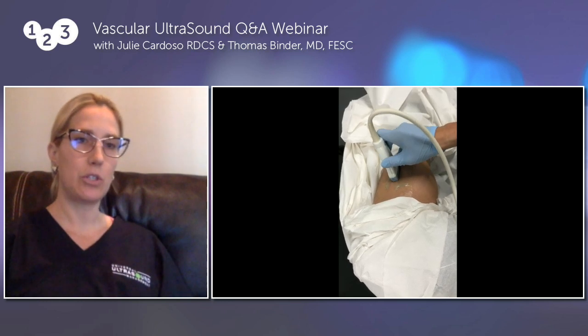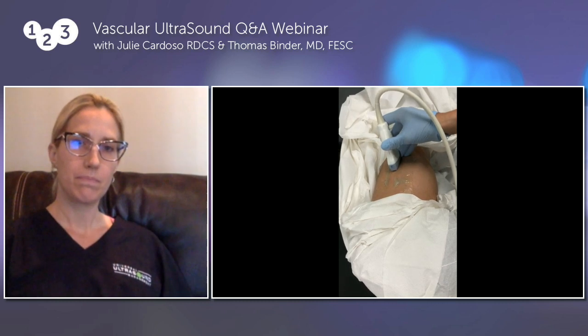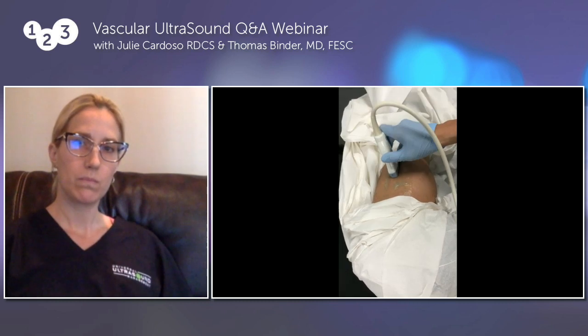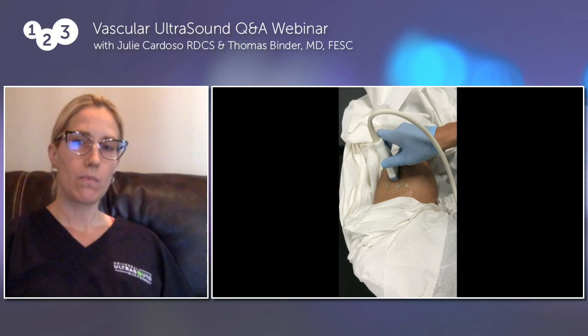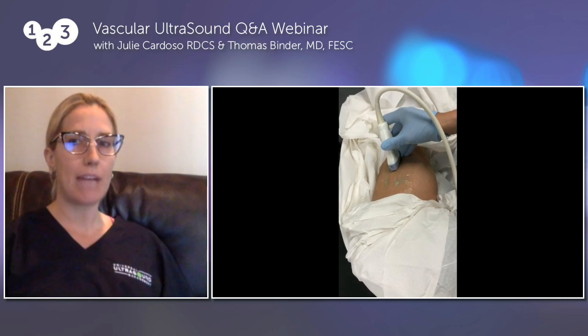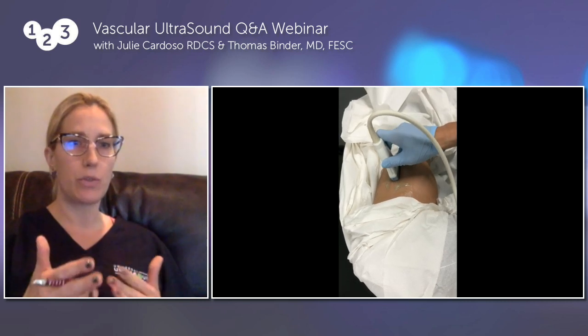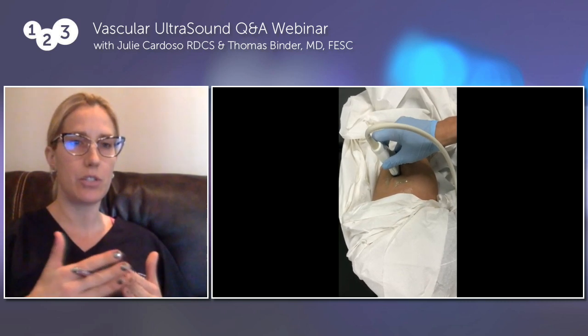So Julie, let me just ask a question here. You can actually see that the transducer at some point lifts off of the skin. Is that a problem usually? No, it depends, because when we're imaging different anatomy of the leg, sometimes, especially veins, they're very tortuous and we're only seeing two dimensions. So this way, when we rock the transducer, we can angle between those planes to get the different visualization of the vessel.